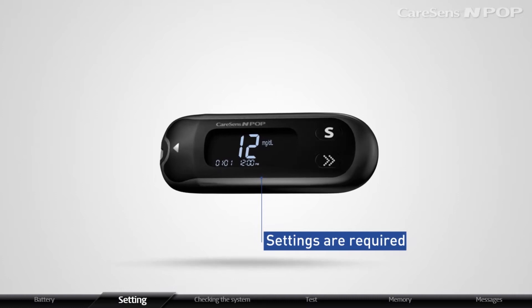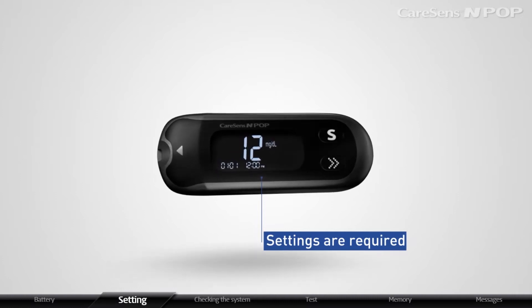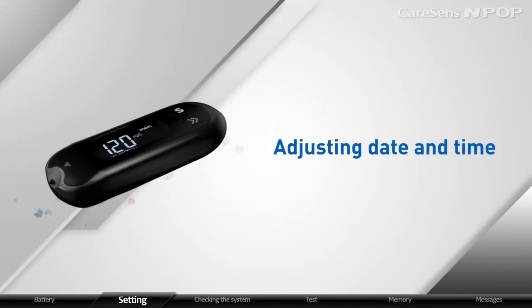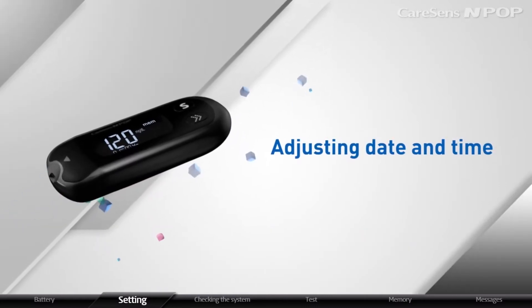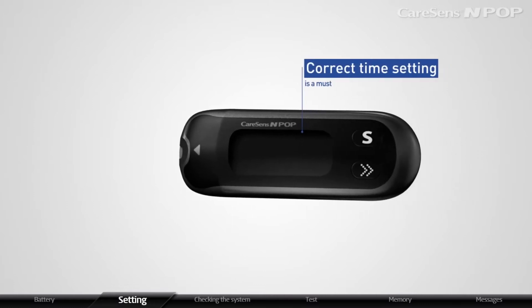In order to use all the smart features of CareSense InPop, appropriate settings are required. In order to manage your diabetes well, correct time setting is a must.